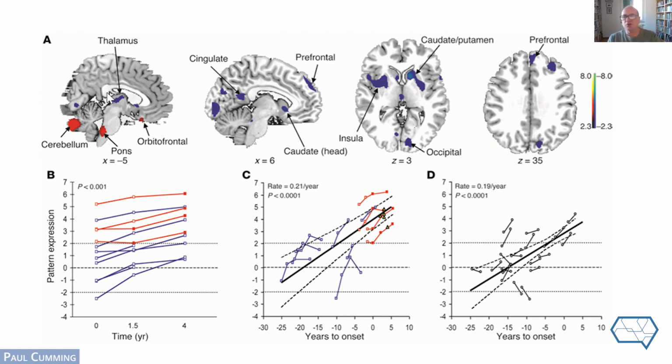If you look at the third tile to the right in the upper figure, that's not surprising, but there is also some hypometabolism in the insula and in the prefrontal cortex, unsurprisingly, based on the early results. And there are also some regions where metabolic activity is relatively increased in Huntington's, in the cerebellum and in the pons, shown in red in the left-hand upper figure.